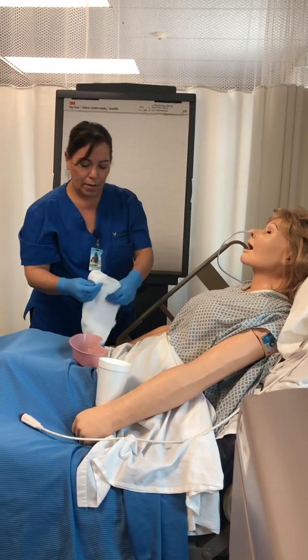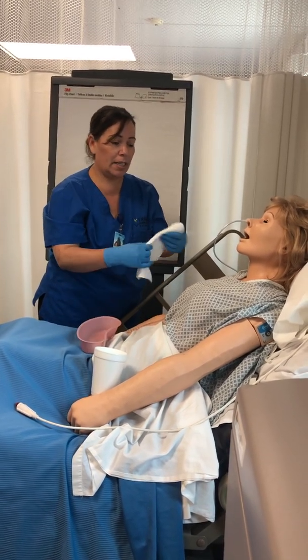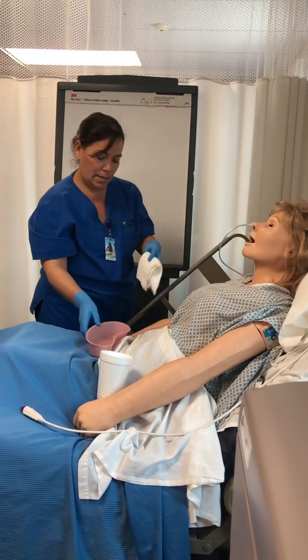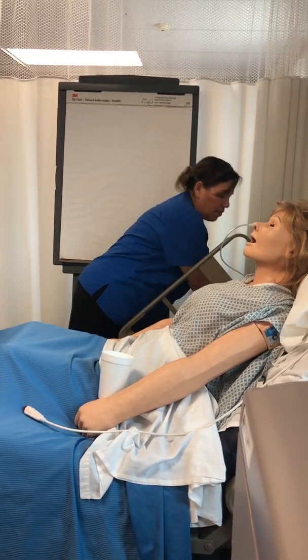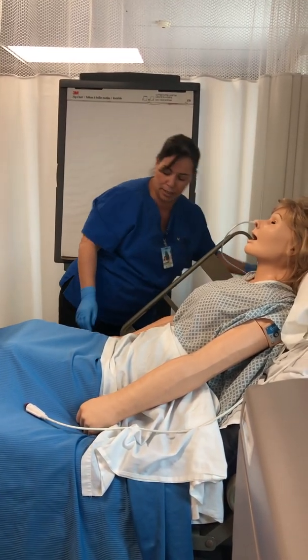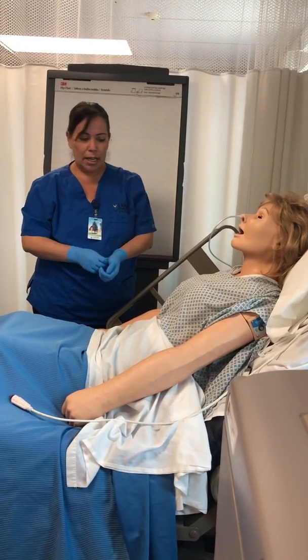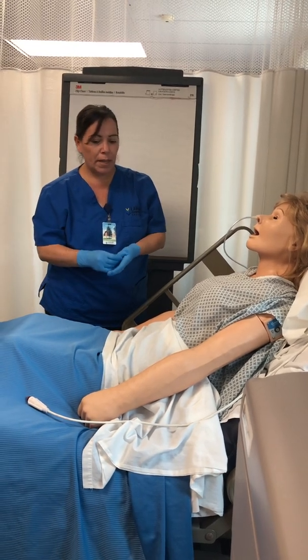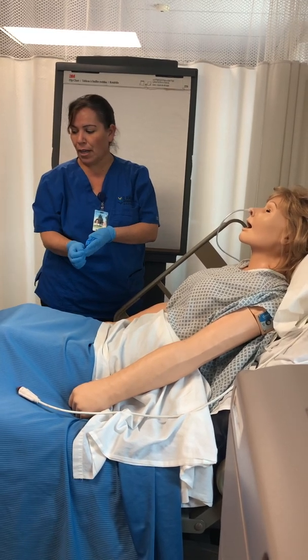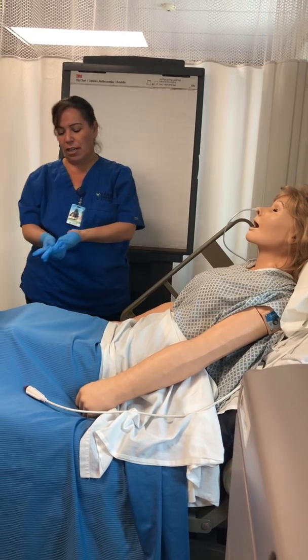You offer the patient mouth care, and then clean his nose. Remove everything. You give the patient his call light and the bed down, and you put the rails up, and you ask the patient if he needs anything else. And then you remove your gloves and do hand washing, and that's it.